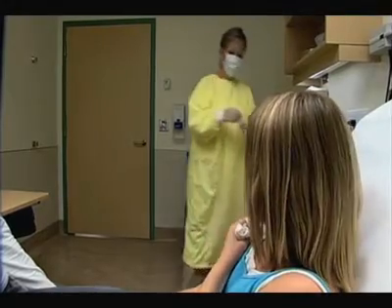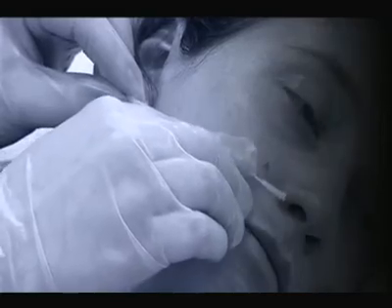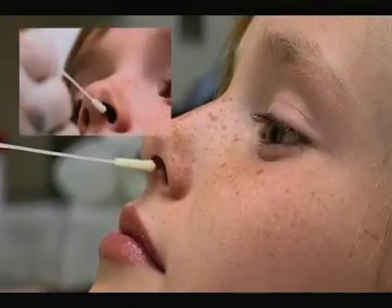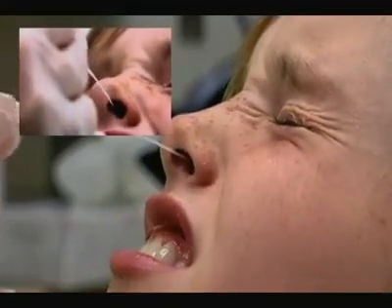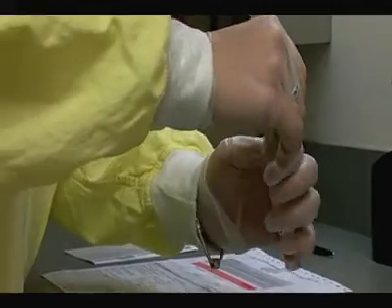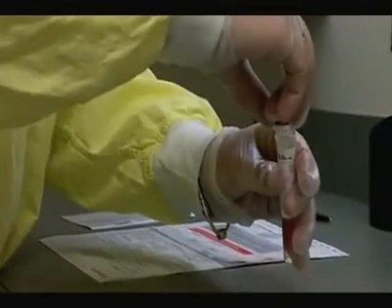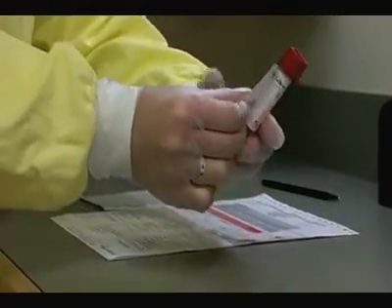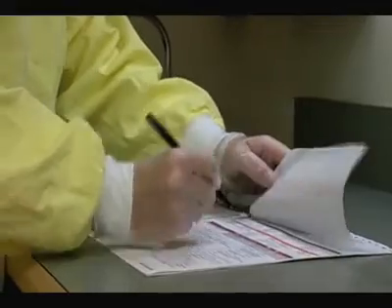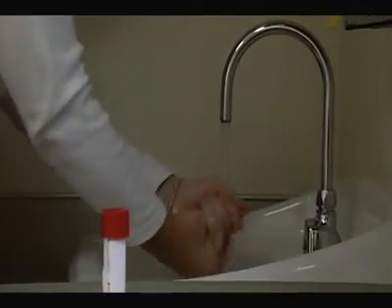The patient's nasal passages should be clear of mucus prior to insertion of the swab. Check the distance from the tip of the ear to the nostril and insert the swab to at least half that depth. Insert the swab into the nostril with a few rotations to help collect more cells from the nasopharynx. This process may cause the patient to sneeze or cough. Snap the swab shaft into the transport medium at the score line, then cap the container. Complete the labeling of the sample and requisition prior to sending it to the laboratory for testing. Remove your protective equipment and perform hand hygiene.